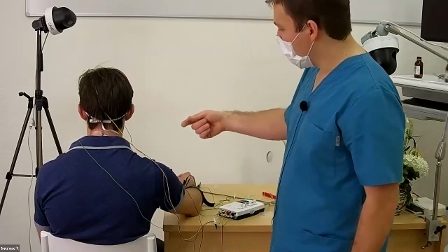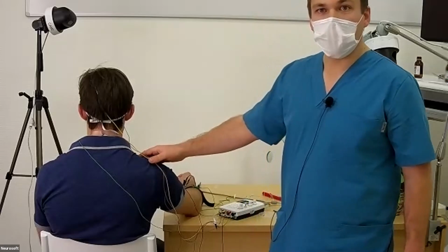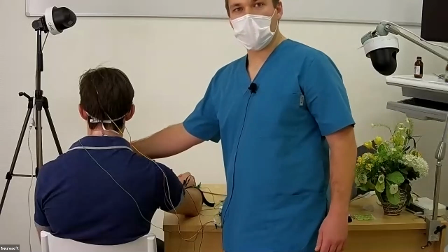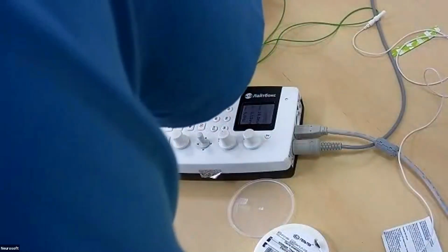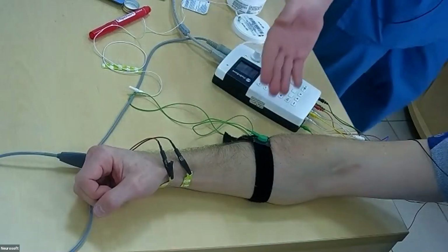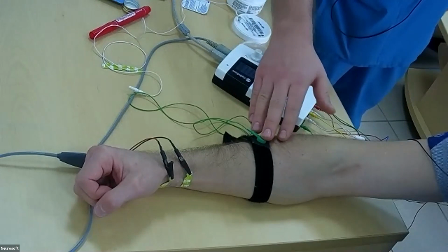We also register the peripheral nerve, from the ipsilateral Erb's point to the contralateral Erb's point. We also need a ground electrode. Usually it must be set between the stimulation and registration channels, for example on the arm.